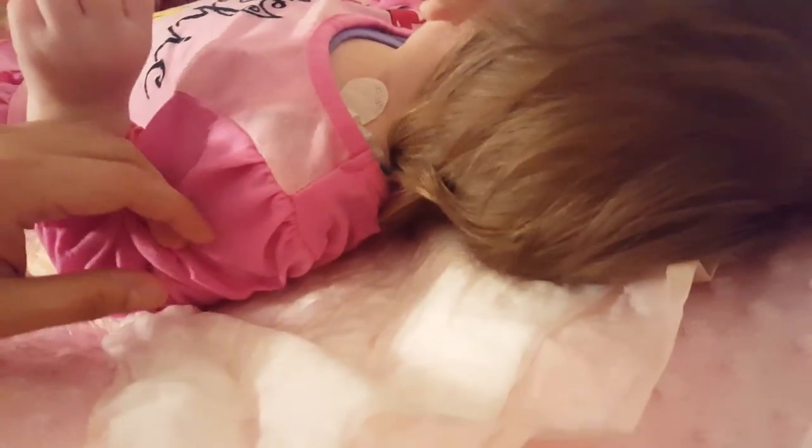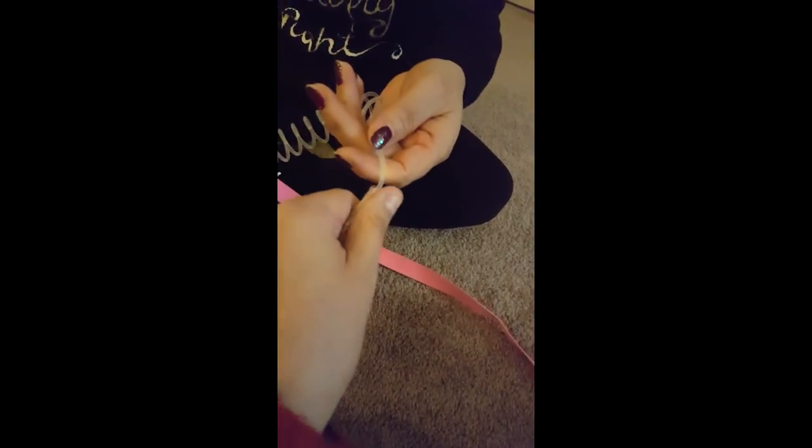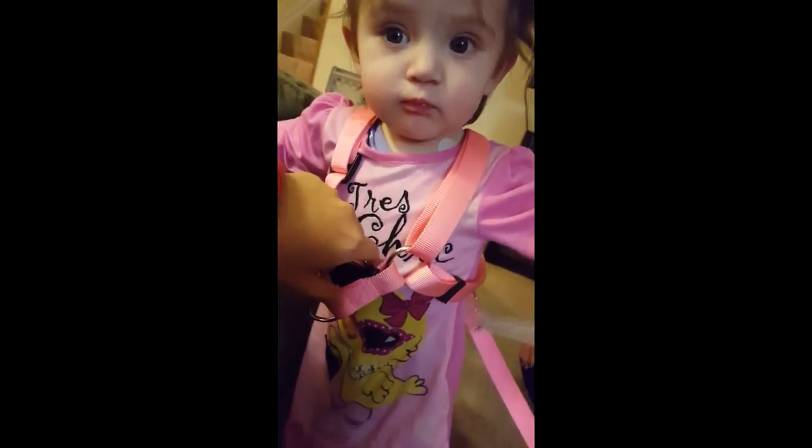That's it — she's all set. So we're here downstairs now and I forgot to press-and-seal this part too, just because she's on the floor and poops or whatever. I press-and-seal that too. And then we created this little bucket thing where we put the TPN in — it's attached to this harness. She's attached to it. We just need to tape her line to this harness so that when she walks, she can have a little bit of freedom.